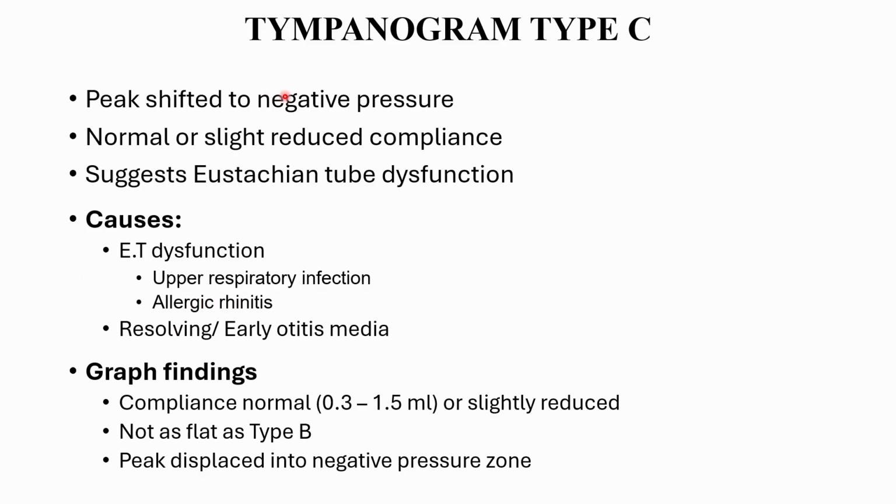Or this type C can also be present in resolving or early otitis media. So one question can come, or anybody can ask you, if a patient has type B, which we'll see next, and now after treatment it has become type C, whether it has improved or deteriorated.